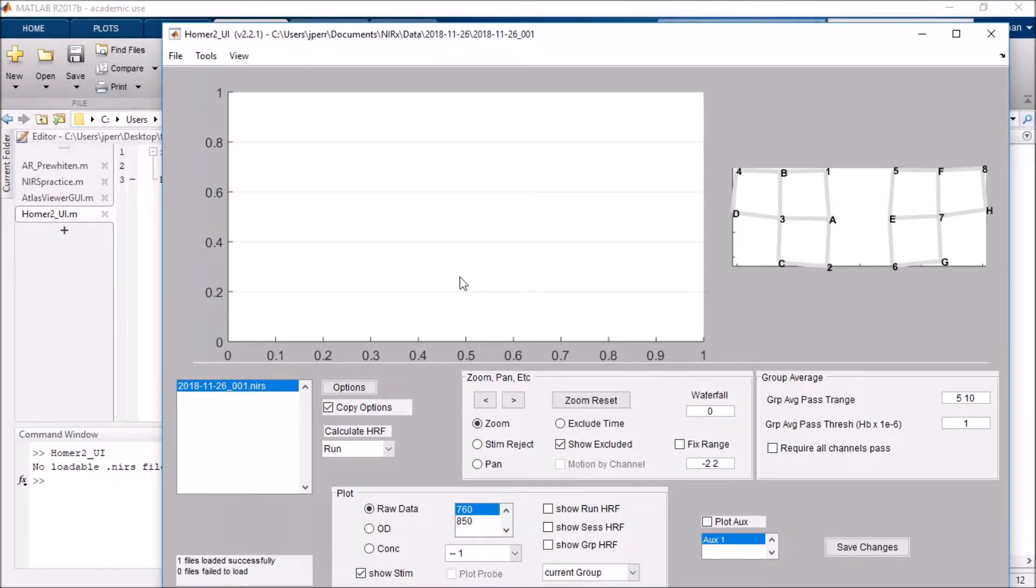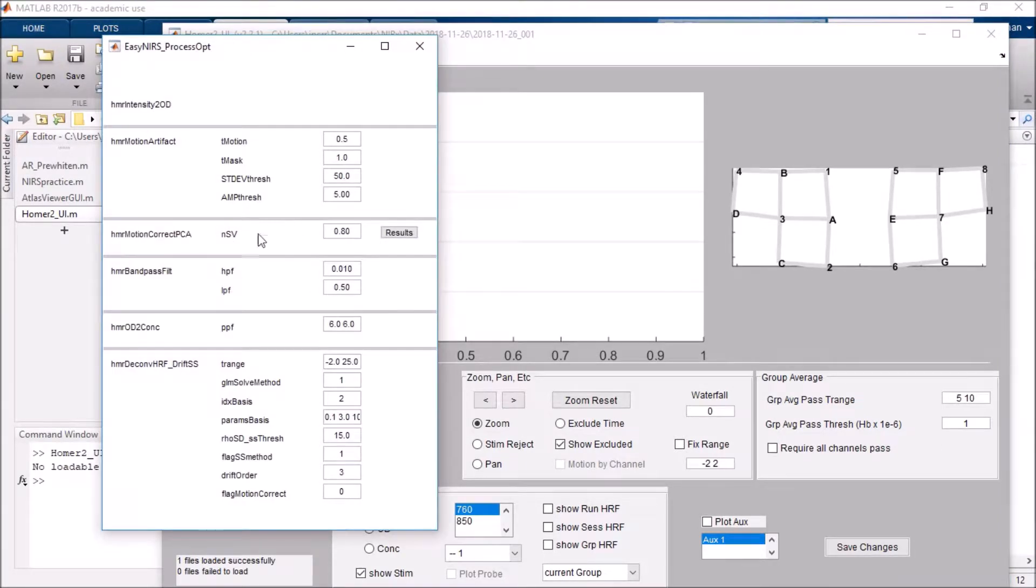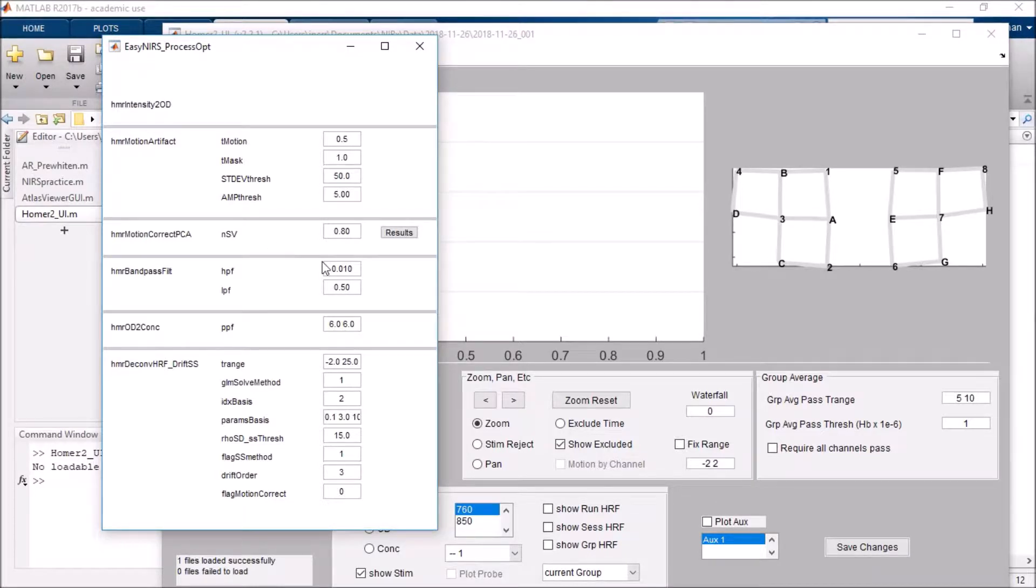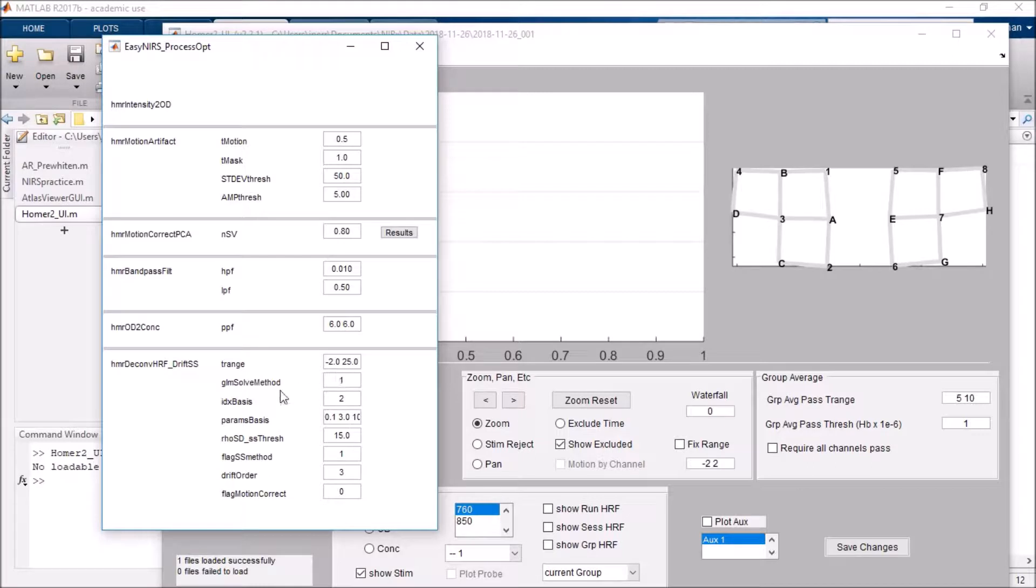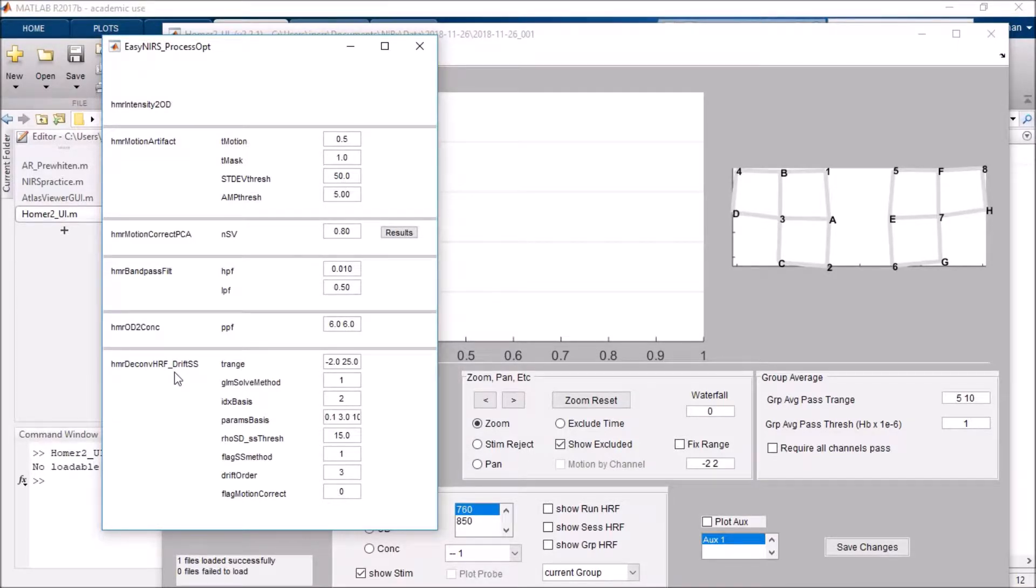Next, it will ask me which processing pipeline to use. It's already got a default one loaded in that I've put together. Disregard the values here. However, do note this last function. This is the deconvolvehrf function, which will actually build a model and extract betas. You will need that in order to overlay concentration data.